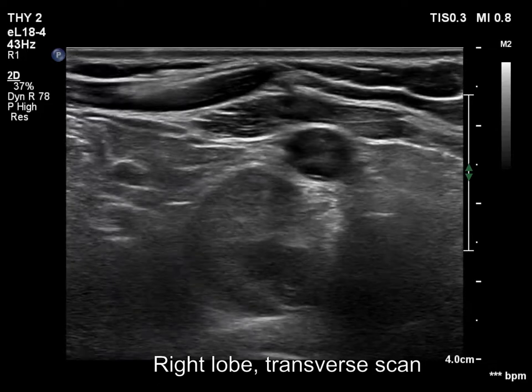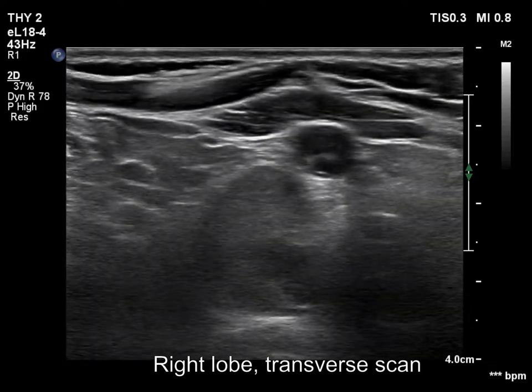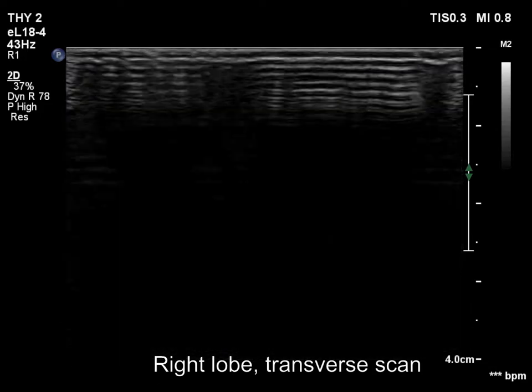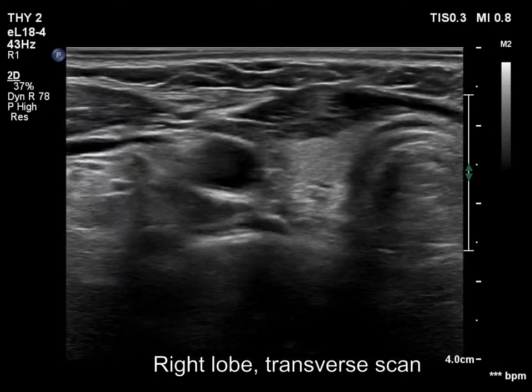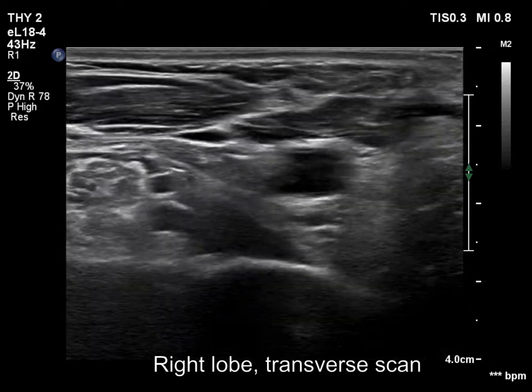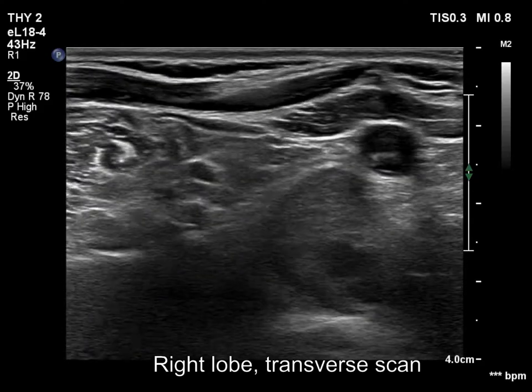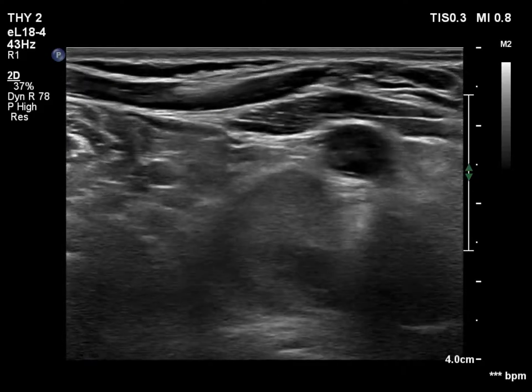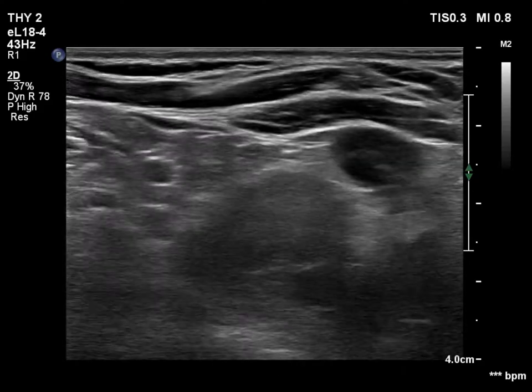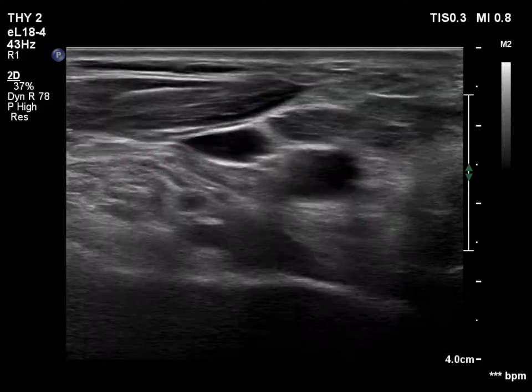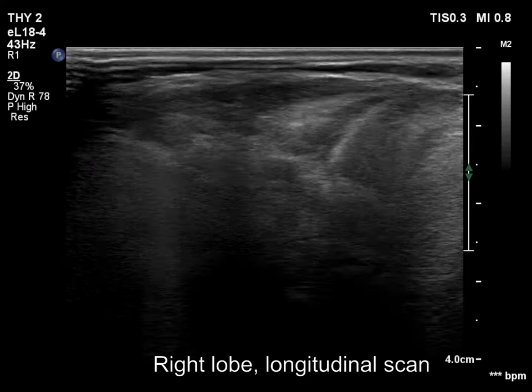The pattern of the thyroid remained unchanged. This time, the part below the thyroid was also examined in the transverse section, thus discovering the enlarged parathyroid gland.